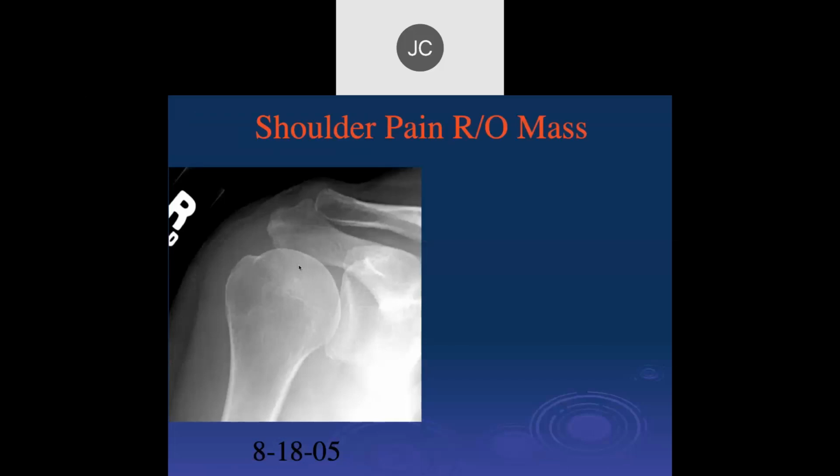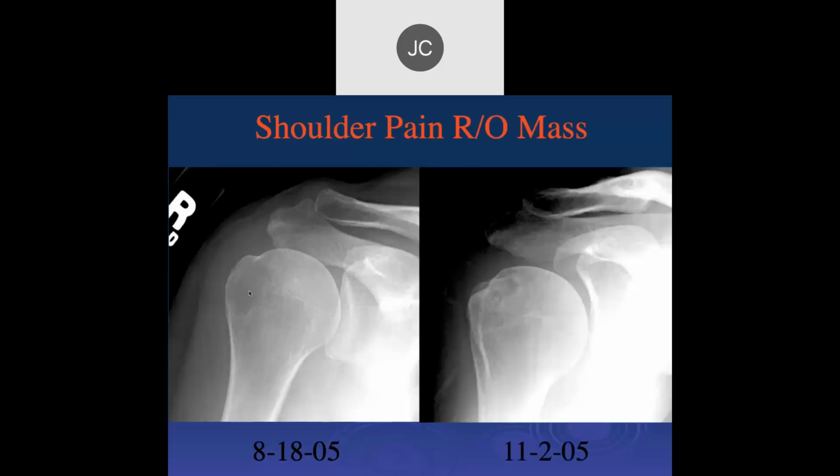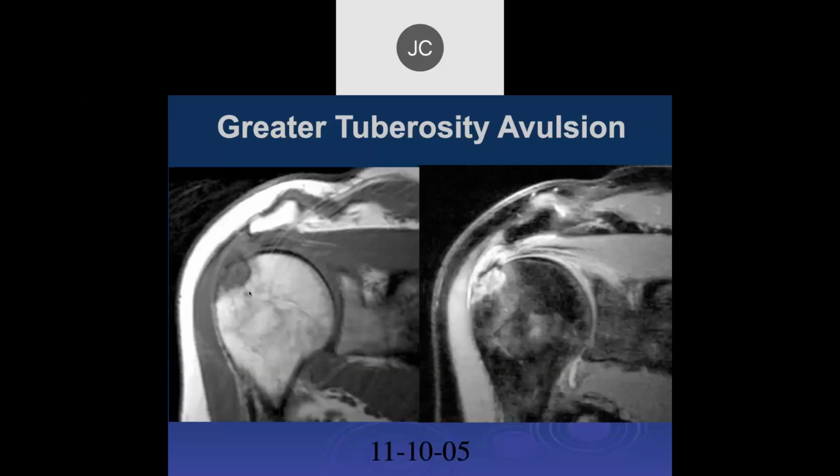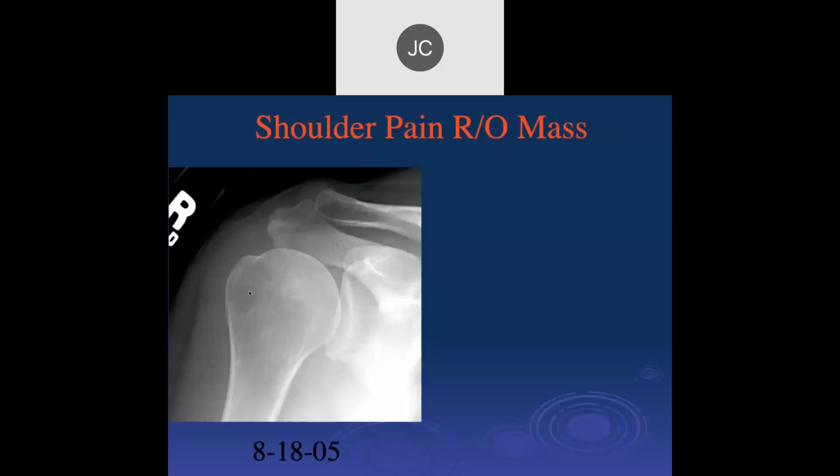Okay, shoulder pain, rule out mass. This radiograph, maybe in the greater tuberosity, there's some lucency there. Now the patient came back on 11/2/05. That lucency is now kind of irregular. It's a mixed signal. You see what the MRI scan is like. So maybe an avulsion injury. And if you go back here, actually, there's a normal lucency here.